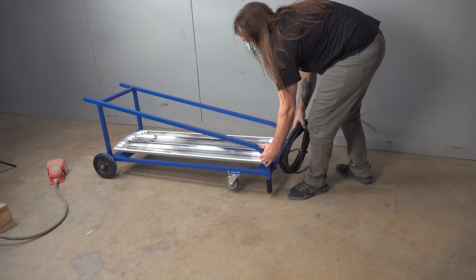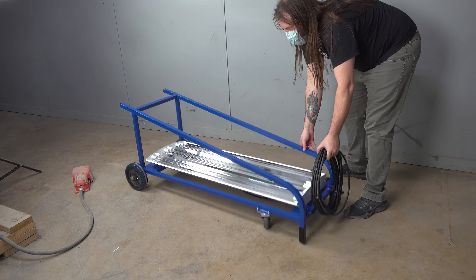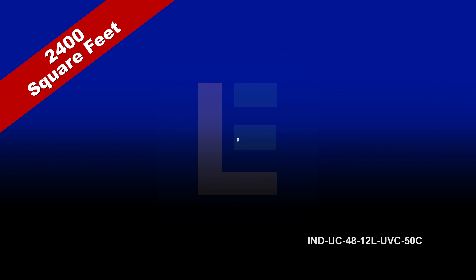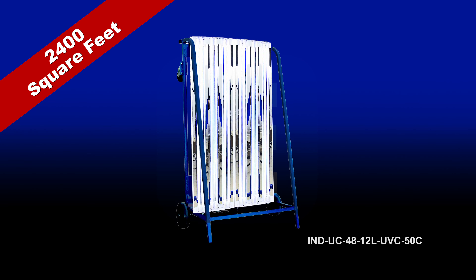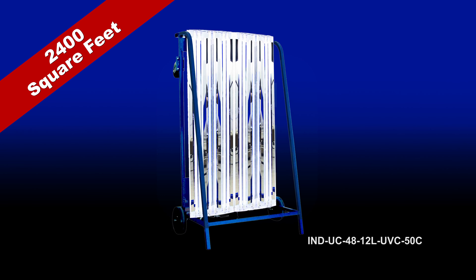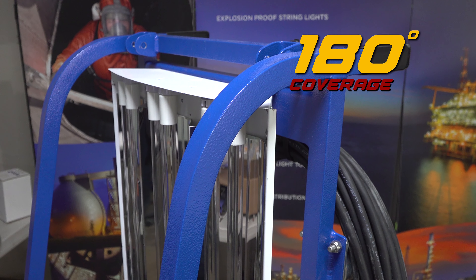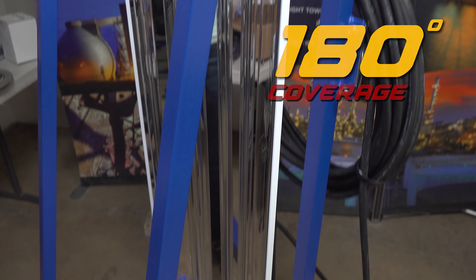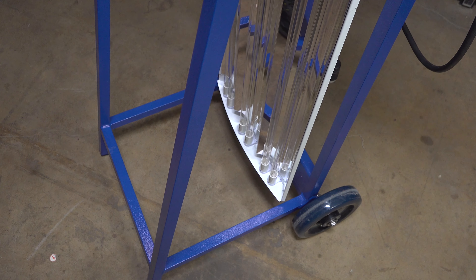The IND-UC48-6L-UVC-50C Cart covers an area of 1,200 square feet and features 6 powerful UVC fluorescent lamps. The IND-UC48-12L-UVC-50C covers an area of 2,400 square feet and comes with 12 powerful UVC fluorescent lamps. Both carts offer 180 degrees of coverage, and multiple carts can be used to cover a larger area with the same efficiency and effectiveness.